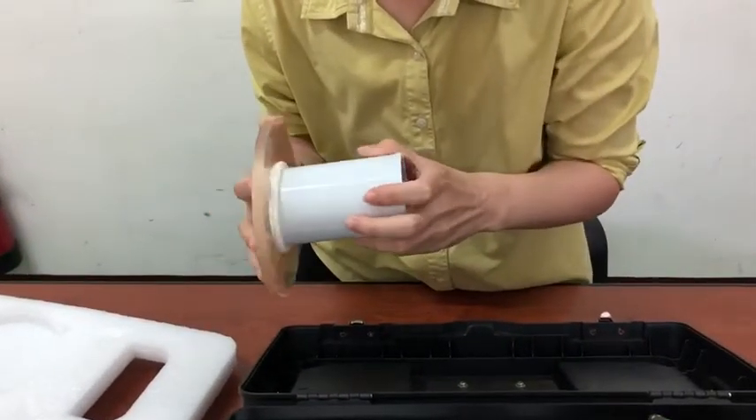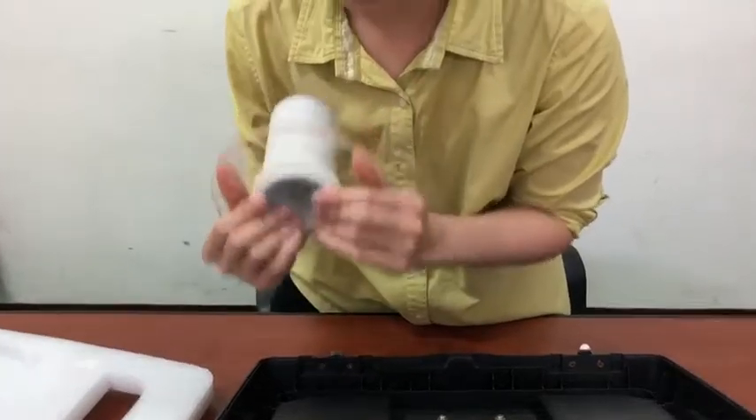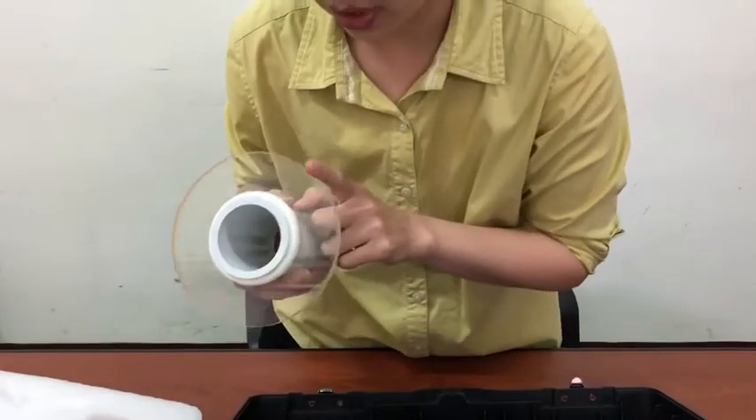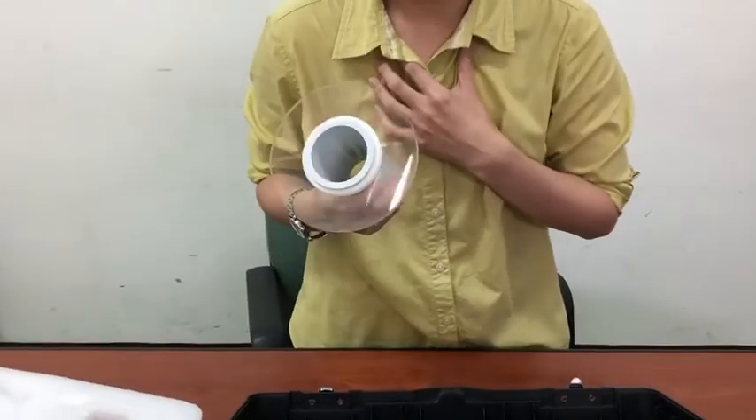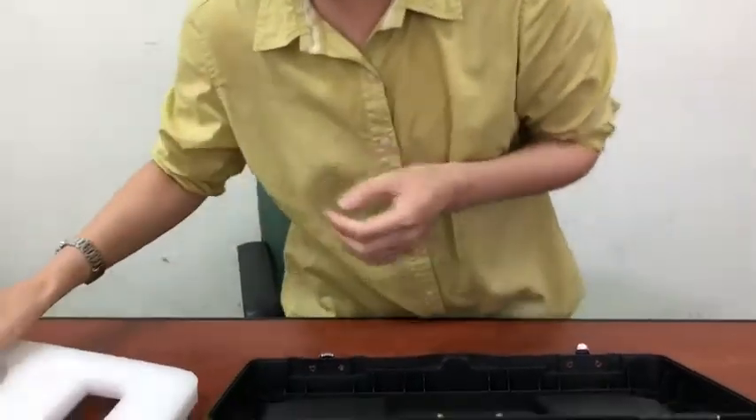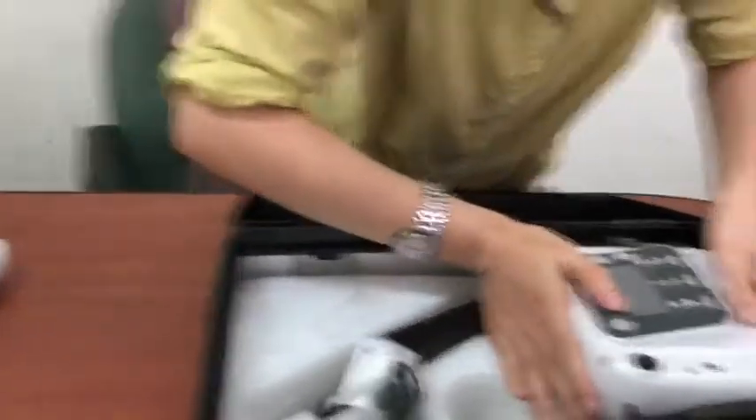So the first thing we have to do is combine the cone with the back shell together. It's really easy — just put them together and push the shell to the end. The shell will be able to protect our operators during the exposure.